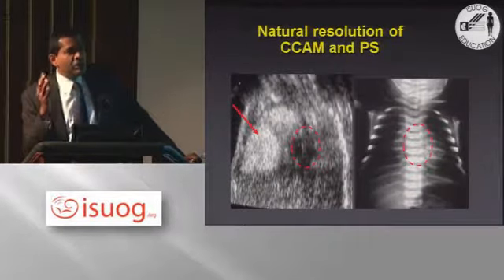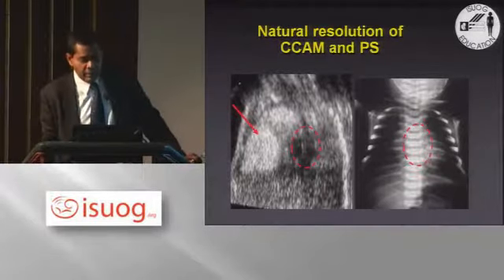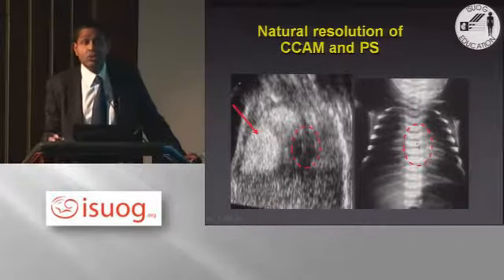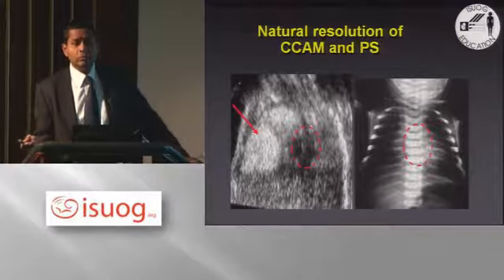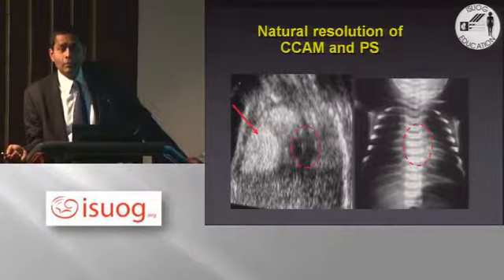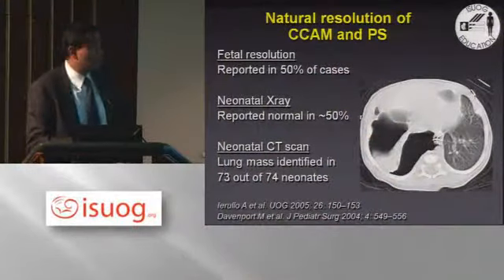If we talk about the natural history of echogenic lesions, everyone here is familiar with this appearance, okay? I'm sure if you've diagnosed it, you see antenatally an echogenic lesion, you see the heart, you see this huge great thing, and then the baby's born, and your neonatologist says it's gone. Is that familiar here for most people? And then you say, okay, it's resolved, and then you send the baby home? It's gone, right? Send the baby home. Okay, good, excellent. That's certainly folklore.